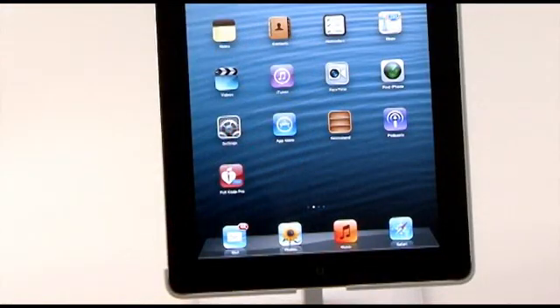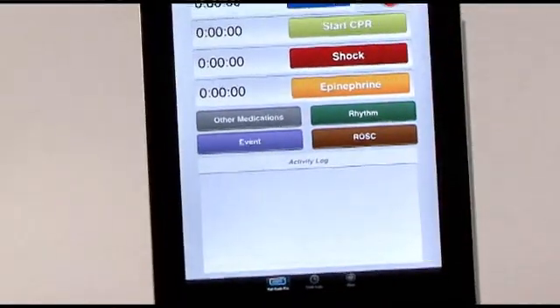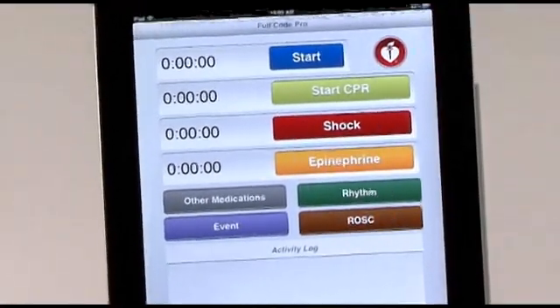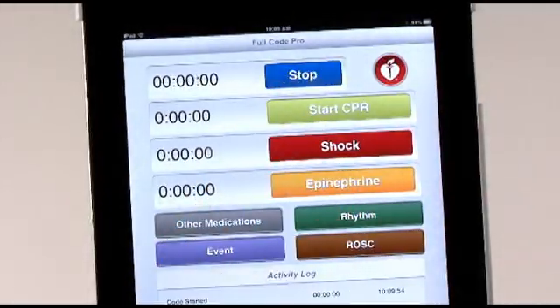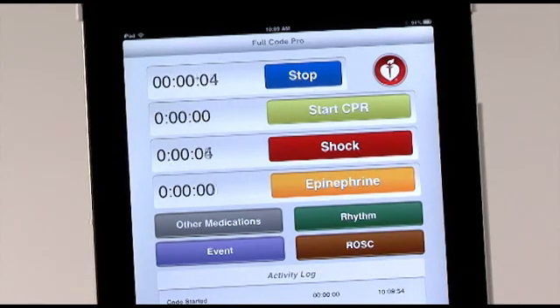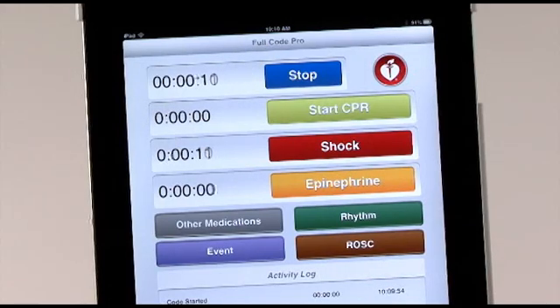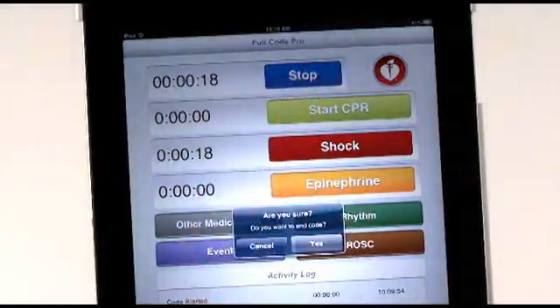The code screen will appear when you open the app. At the top of the screen, the blue Start button begins the code timer. When the Start button is pressed, the button label changes to Stop. During the code, the code timer displays the elapsed time since the code began. The code timer will stop when you press the blue Stop button in the upper right.